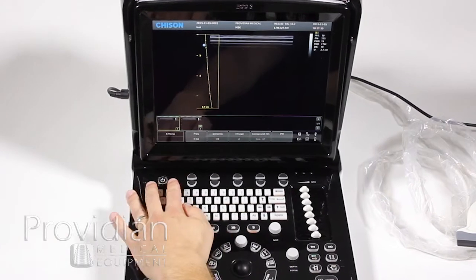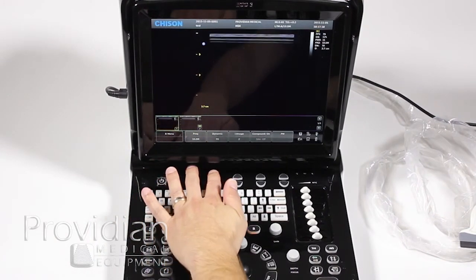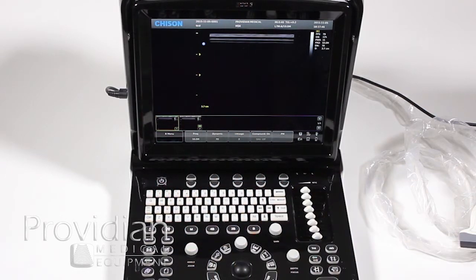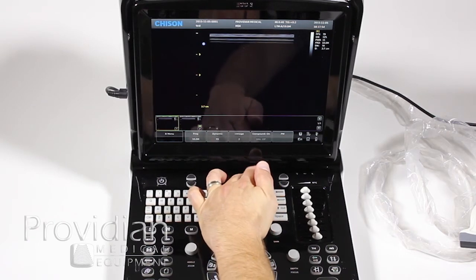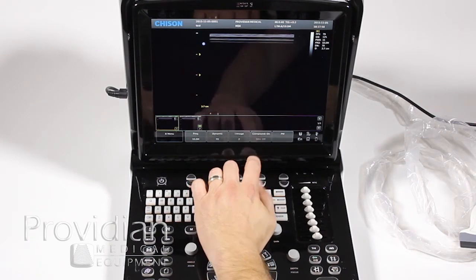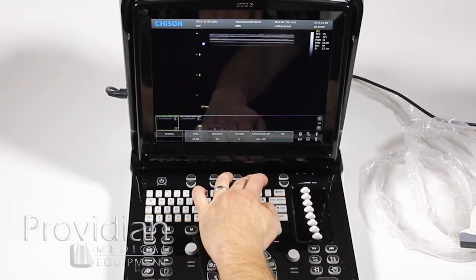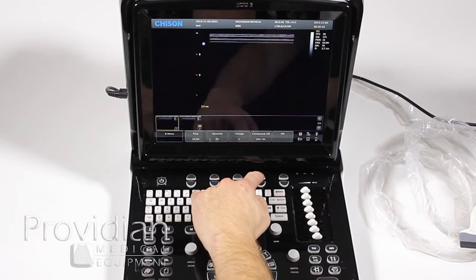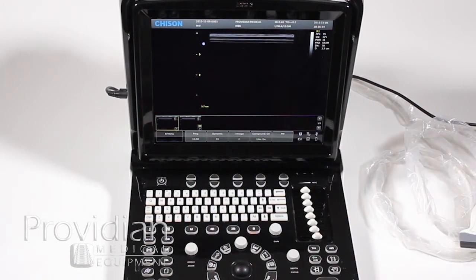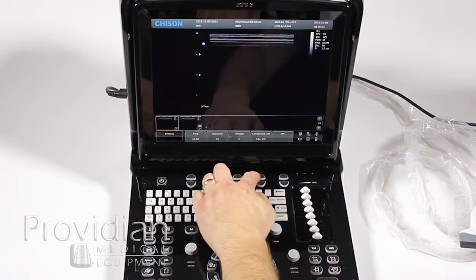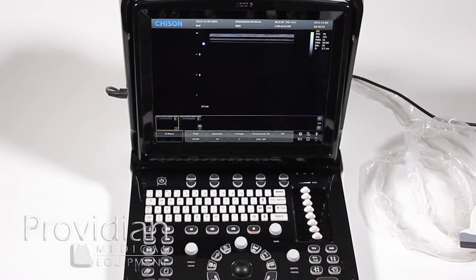Down along the bottom when you unfreeze, we have our image optimization controls. We already went over frequency. Here's where you change dynamic range. iImage is a Chison feature designed to optimize the image based on what it's looking at, using general gain controls. We have compound imaging and speckle reduction, which you can turn on and off. In this preset, compound imaging is on and speckle reduction is off. To turn on speckle reduction, you must turn off compound first, then enable SRA, then re-enable compound. This behavior may change in a future version.